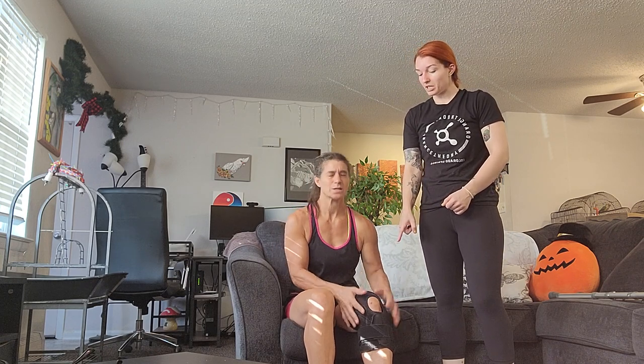Hello, so today we're gonna be working with Jenny here, but I call her mom. Her knee is incapacitated at the moment. She is minimal weight-bearing on this side, so we're gonna have her help to transfer from sitting to standing using crutches today.